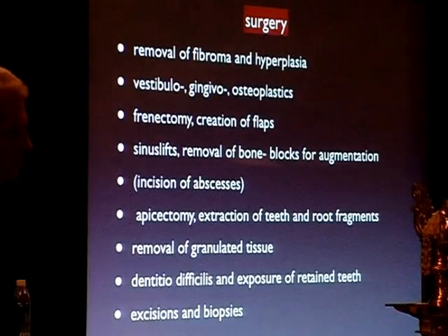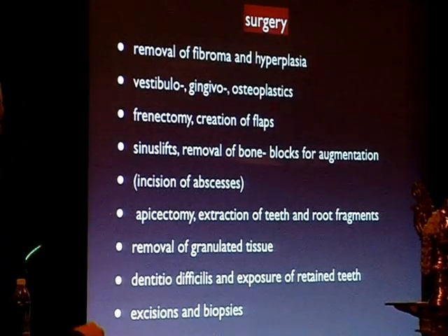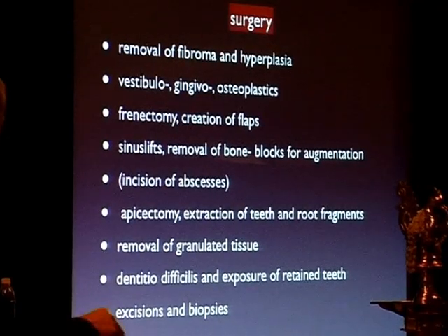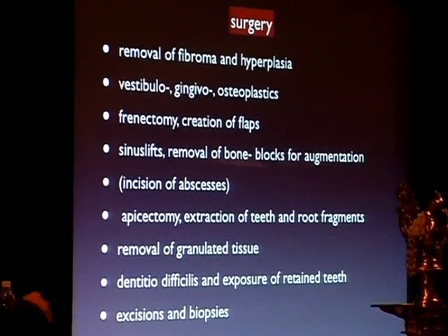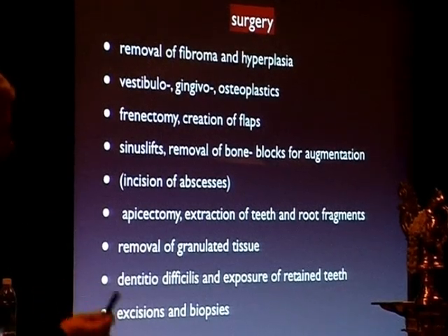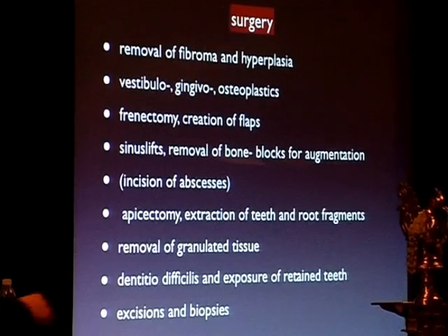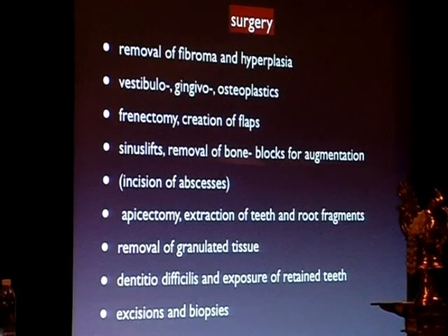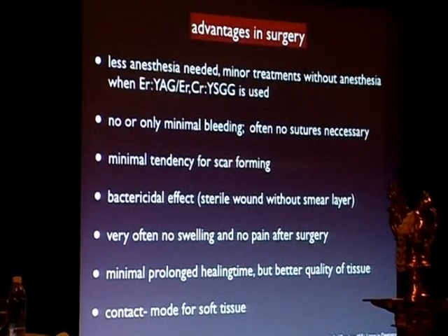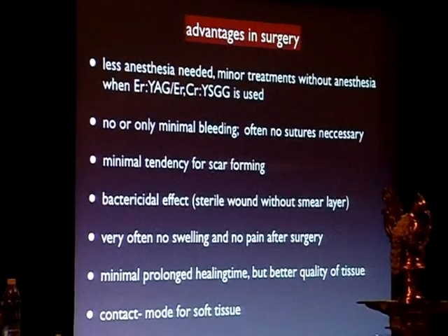Removal of granulated tissue with both lasers, operculectomy and exposure of retained teeth with both lasers, but only if you have to treat soft tissue. If you have to treat soft tissue and hard tissue while exposing, you have to use the erbium laser, of course. And you can do excisions and biopsies. The advantages in surgery are there is less anesthesia needed.